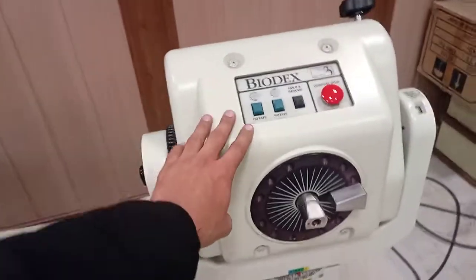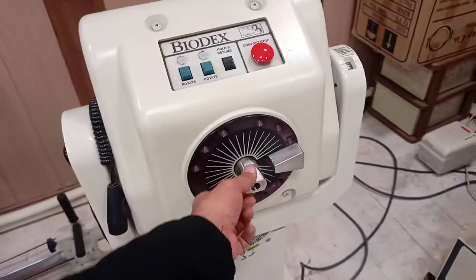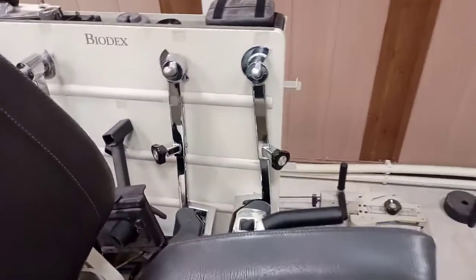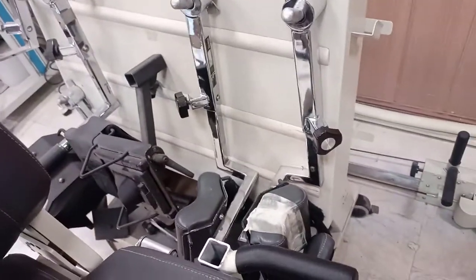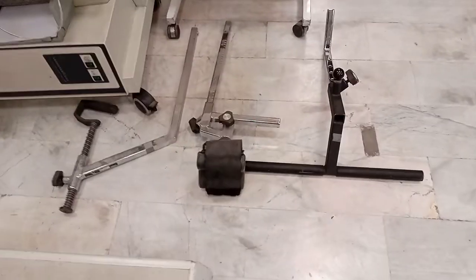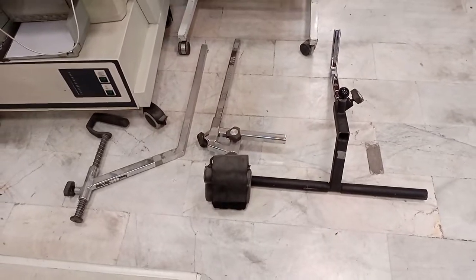This is basically the main dynamometer. This is the shaft where you connect a lot of attachments. Here we can see a lot of attachments for the elbow, for the knee, for the hip, and for the shoulder as well. So these are also some attachments — I have placed them down here.